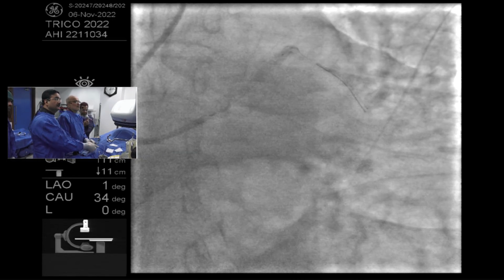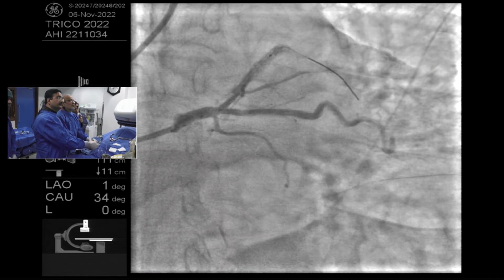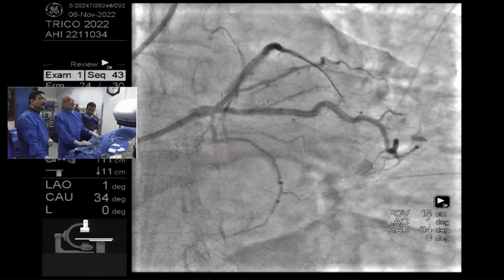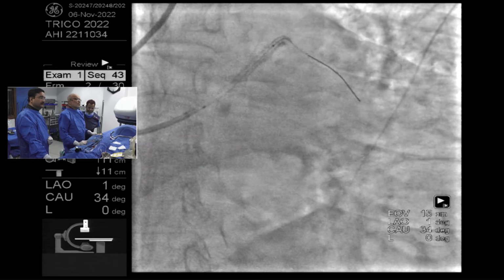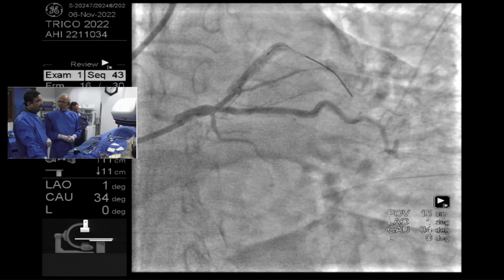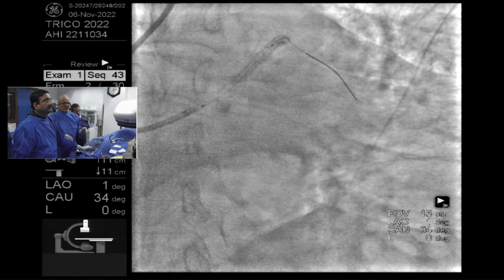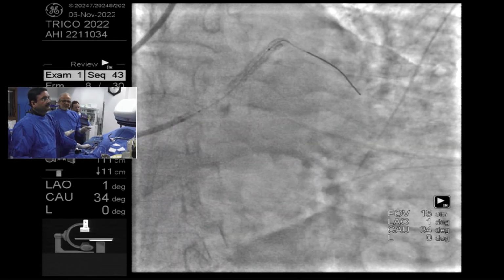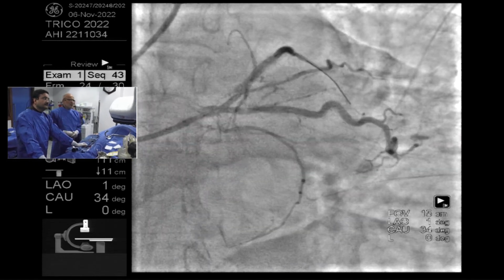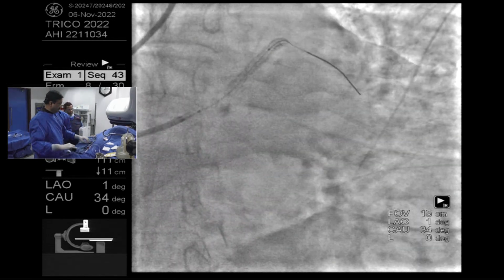Let's check it. Seen it? I will take one more injection here. Maybe 20. We can go with 4 by 18. Yes, good. 4 by 18 at a reasonable 8 or 10 pressure. Then we pull back. If need be, we will work inside, right? Yep. You might have to do part at the left. Yeah, I think so. 4 by 18. Get me onyx.